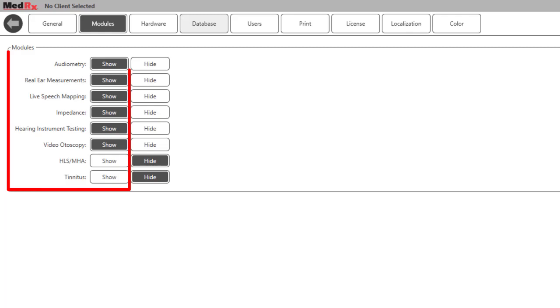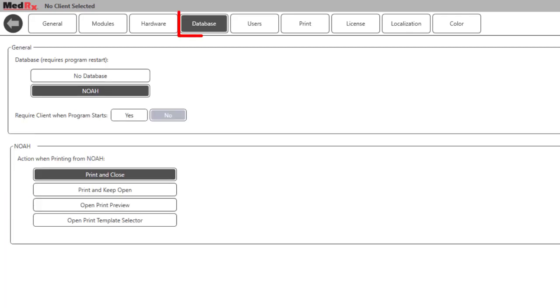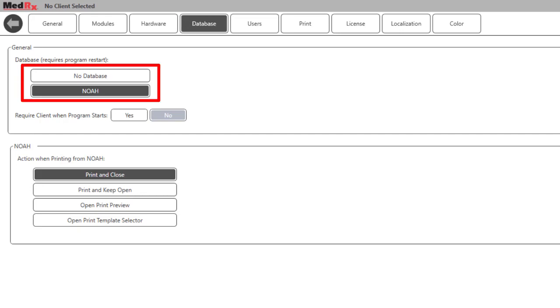You can display single or multiple modules depending on which hardware you have. The Database tab is used to select to use the NOAH database or no database.